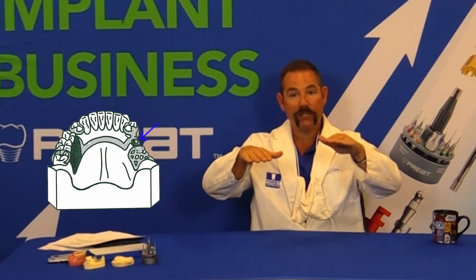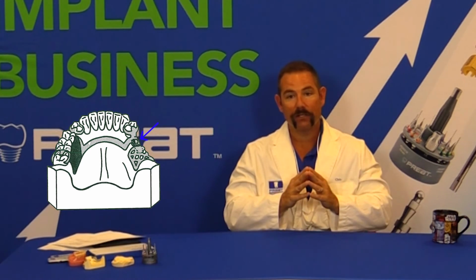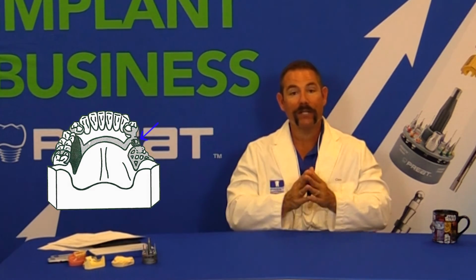Let's allow that tissue supported movement. It won't be bound. This is a great place to use a hinge. Old school technique, used for years. A lot of us have forgotten about it. Let's not forget about the hinge.